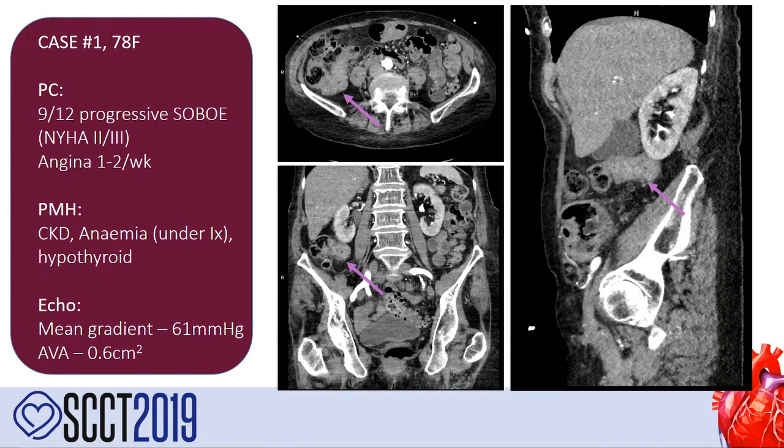Apart from this 7 centimeter long segment of colonic thickening at the right hepatic flexure, all entirely consistent with a colonic cancer. So CT saves the day? Maybe, we'll come back to that.